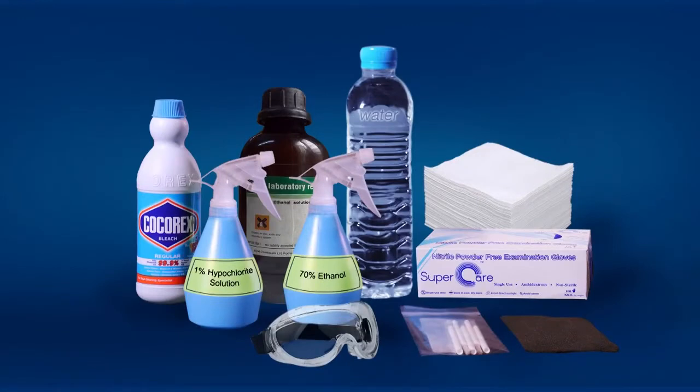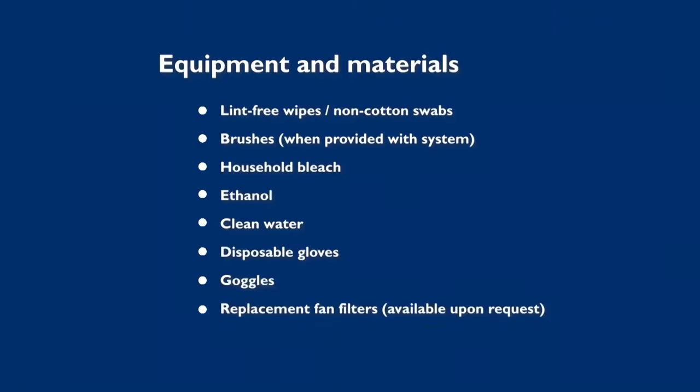In this video, we will demonstrate how to perform the GeneXpert maintenance procedure. Firstly, we would like to describe the materials, reagents, and solutions required to perform GeneXpert system maintenance.